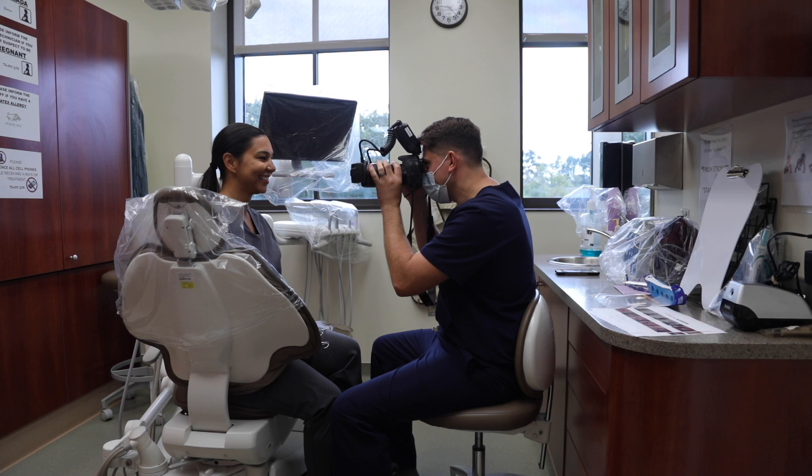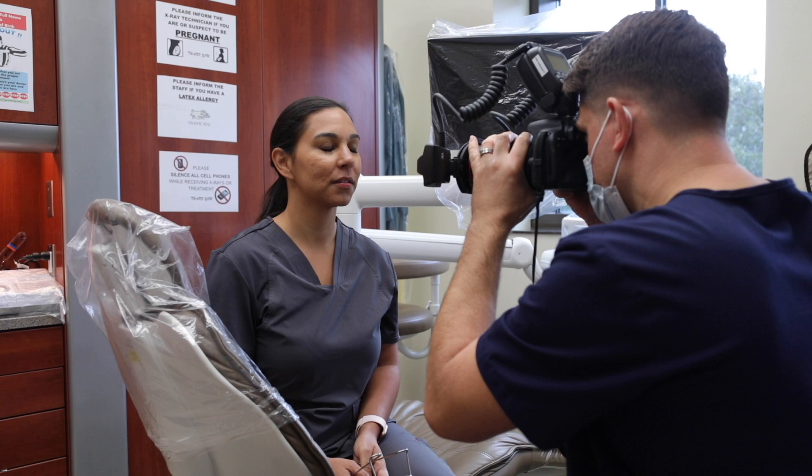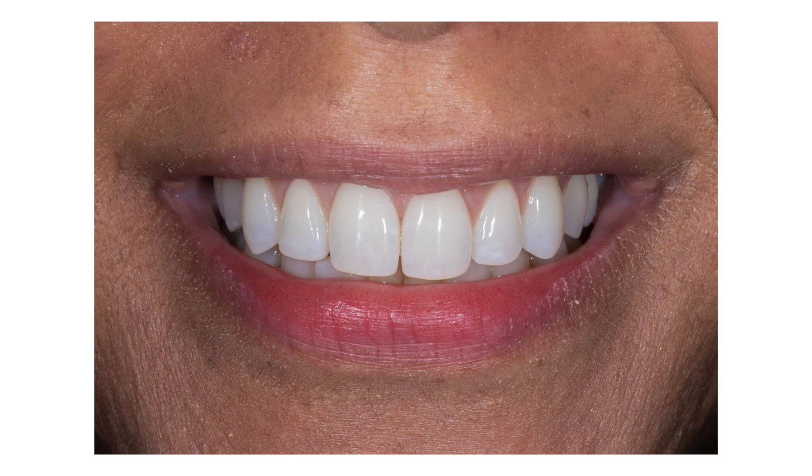This photo will be very similar to the up close repose, except now the patient is smiling. The incisal plane or occlusal plane is usually parallel to the photo frame's upper and lower edges. The philtrum is the vertical center of the photo. Since the patient is smiling, we now have some depth in the image from the front of the mouth to the back of the mouth. To ensure that all the teeth are in focus, we will focus on the canine, so a little in front of the canine is in focus and behind the canine is in focus. If using f25 you notice that some of the teeth are not in focus, this may require you to increase the f-stop to a higher number.